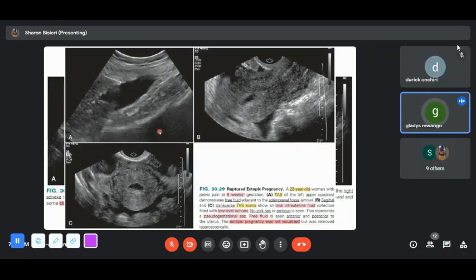Sometimes it may be quite difficult, so if the bladder is not very full and the patient doesn't mind, I think it may be quicker to just do a transvaginal scan, and then you're able to assess the adnexa quite well. Was there any fluid in the POD? No, the main thing that was very obvious was the intrauterine fluid that was quite large. So it was more like the pseudogestation, probably. Was she having any vaginal discharge? Was it bloody or different? No, she didn't report any vaginal discharge.